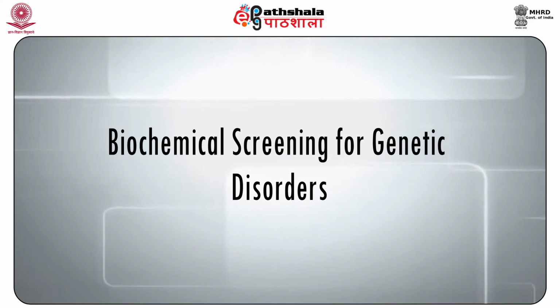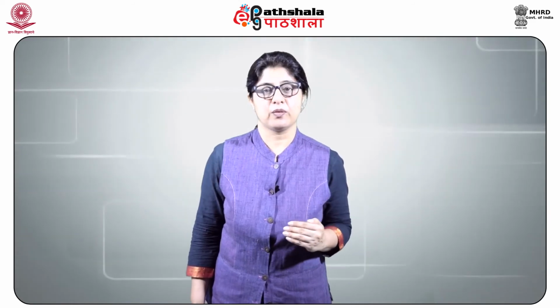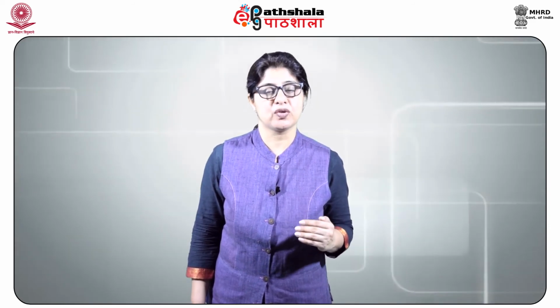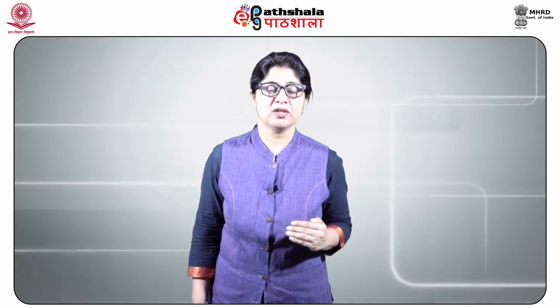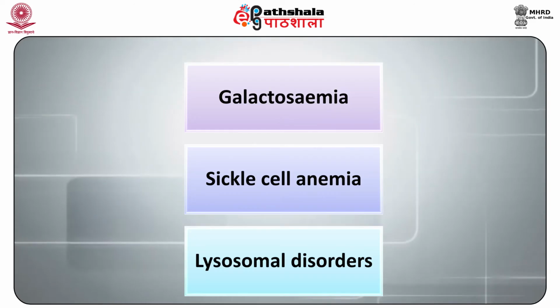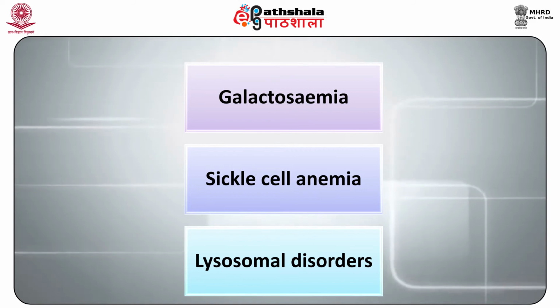Applications: biochemical screening for genetic disorders. A number of marker amino acids and acyl carnitines are measured in dried blood spots after extraction and derivatization in microtiter plates. Screening strategies have been developed for galactosemia, sickle cell anemia and lysosomal disorders.